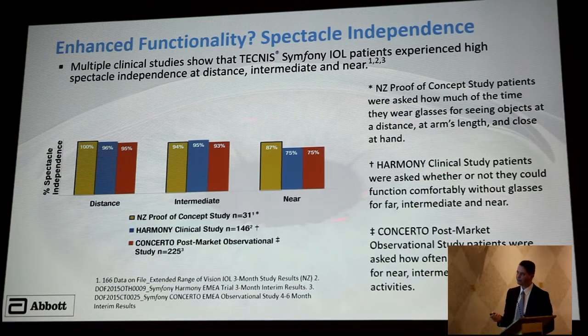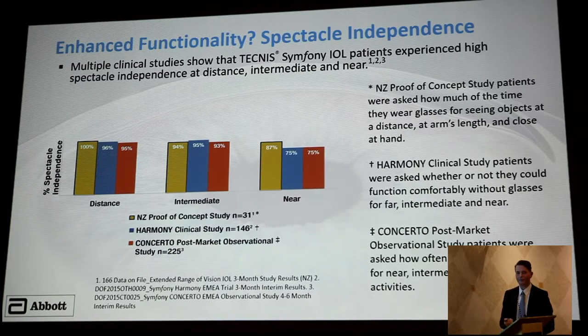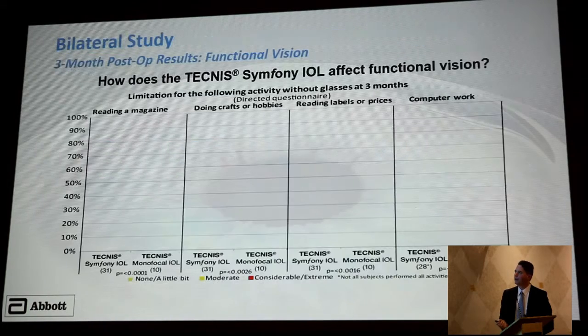So in addressing this, we've really moved from targeting both eyes for distance to be plano, to the non-dominant eye being about a -0.5. And when you do that, you can bump that curve of near acceptability up to be in the 90% range, where the patients are for intermediate distance. Well, that's a surgical issue, but if you're refracting your patients and you see that one eye's a little bit myopic, that's good.